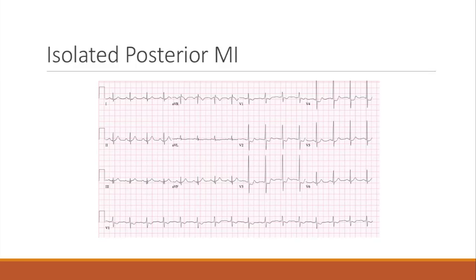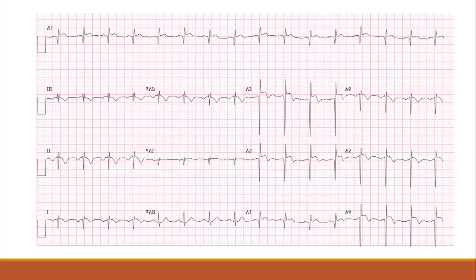This is actually an isolated posterior MI. The reason this looks funny is because all of our EKG leads are on the front of the chest, and when the back side of the heart is infarcted, if you had EKG leads on the back — which we do sometimes — you would see ST elevation. But because you're viewing that ST elevation from the front, it looks like ST depression. What I'm going to do is flip it over and pretend like you're holding it up to the light and looking through it from the back. Watch how much more it jumps out at you. It's just part of your pattern recognition — your brain sees ST elevation easier than ST depression.